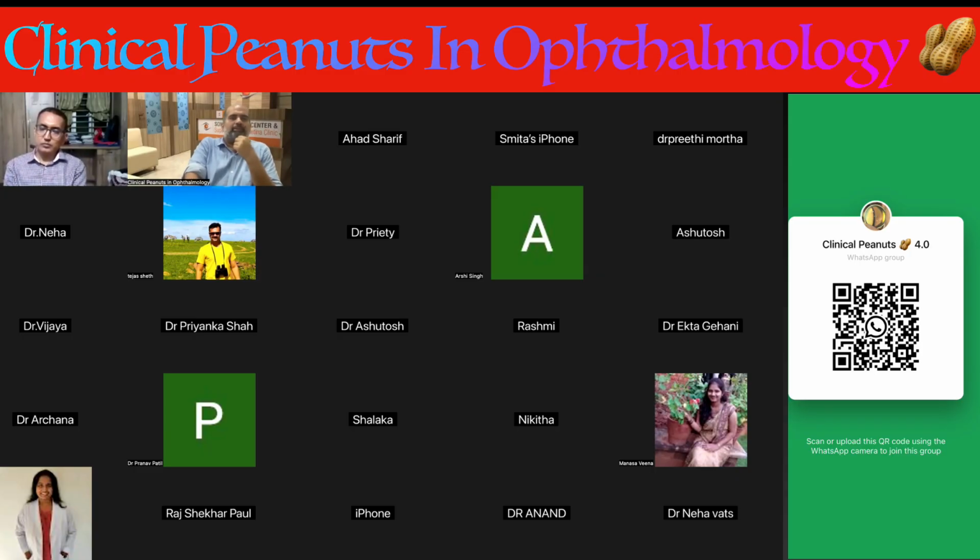Another question is, after visco wash behind the IOL at the end of the surgery, will the IOL position change? No, once you have thoroughly washed the visco, there is no point. Generally it does not change.